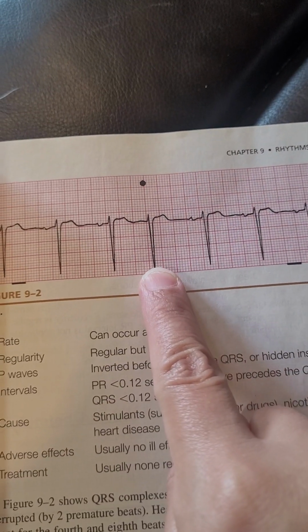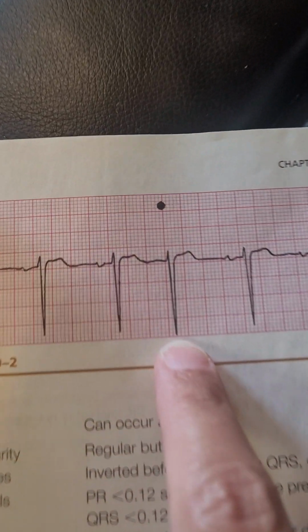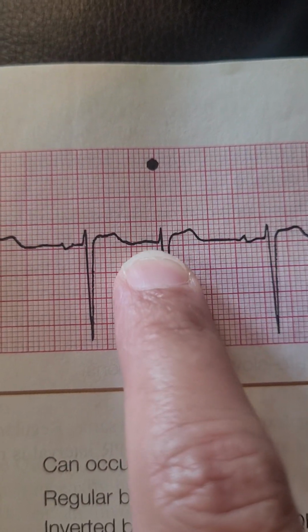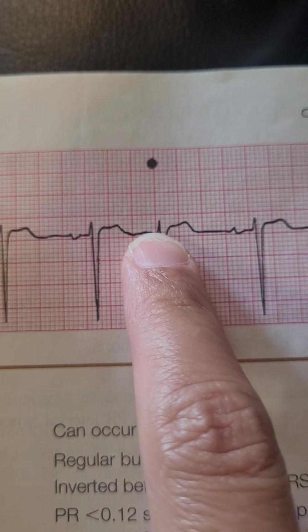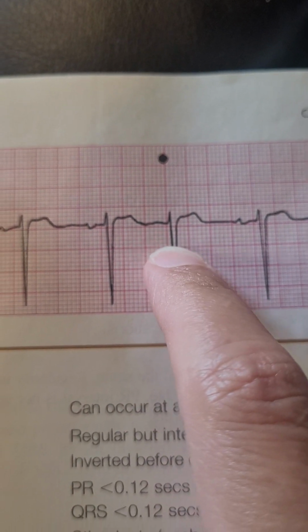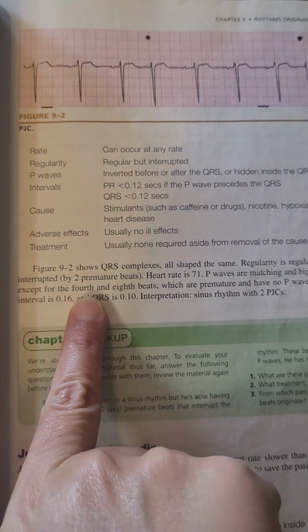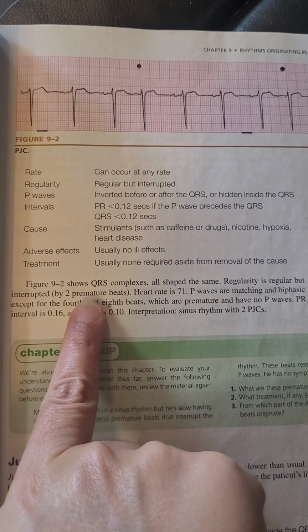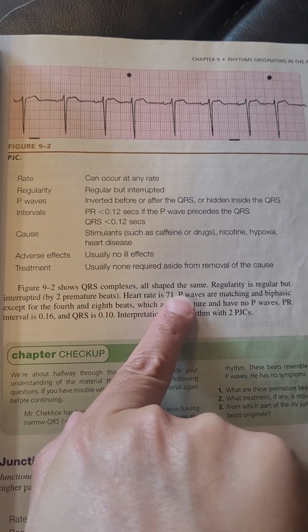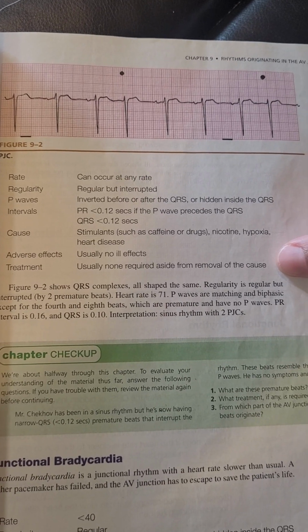So this rhythm would be regular but interrupted, and you've got a PJC here. How do you know it's a PJC? Because you have a premature beat but no P waves. See, it says figure 9.2 shows QRS complexes all shaped the same. Regularity is regular but interrupted by two premature beats.